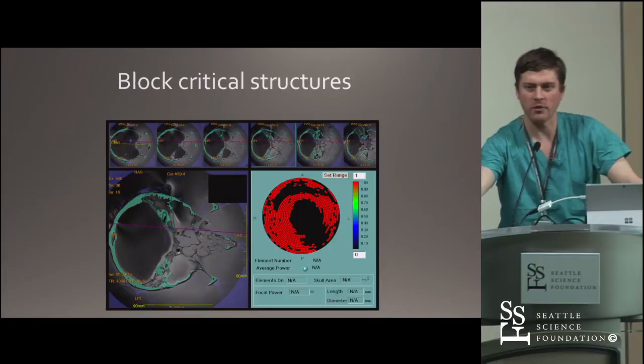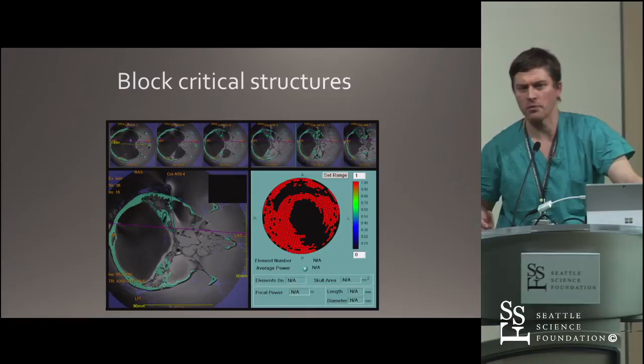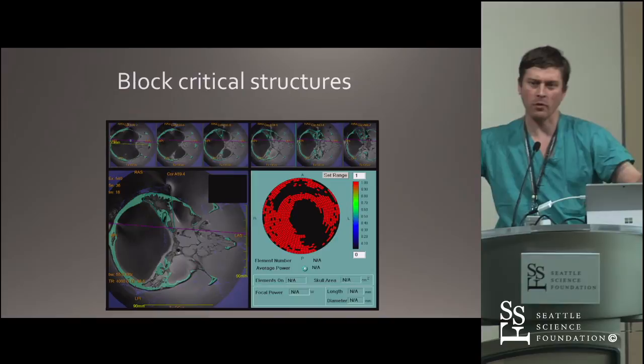There's energy that gets deposited in the shadow of the target, and that's important because with things like the petrous bone, you've got the hearing and facial nerves, and so we don't want to have energy being deposited into the petrous bone and heating it up. So, similar to the radiation oncologist blocking out areas when they do Gamma Knife, we can actually block out the petrous bone and say, I don't want to have any energy getting deposited at the petrous bone. I want you to use all the other beams that we have available of this 1,000-beam helmet to just shoot at the angles that miss the petrous.